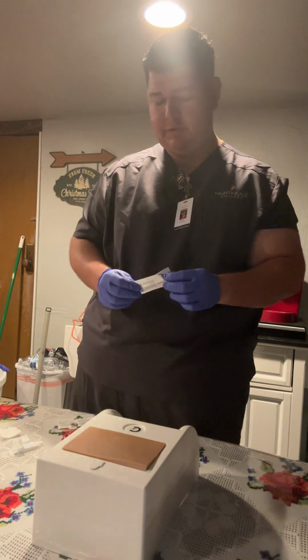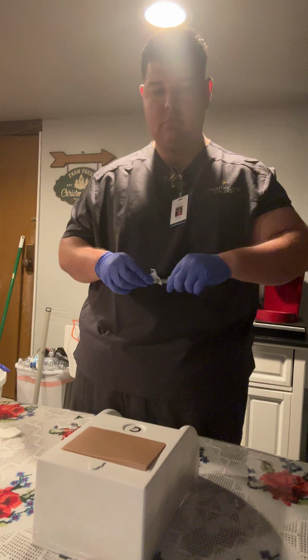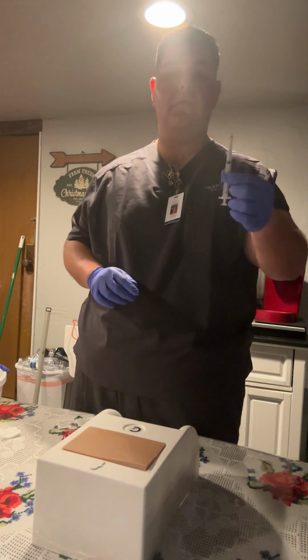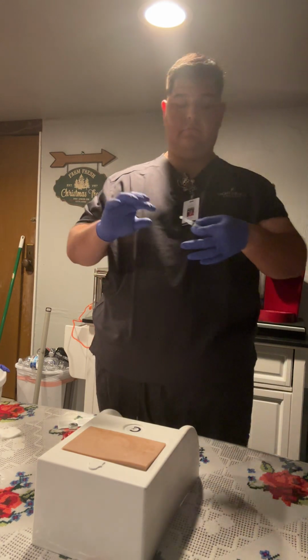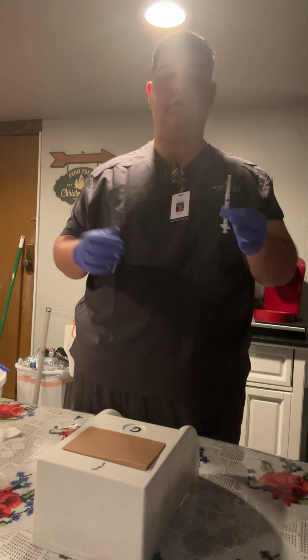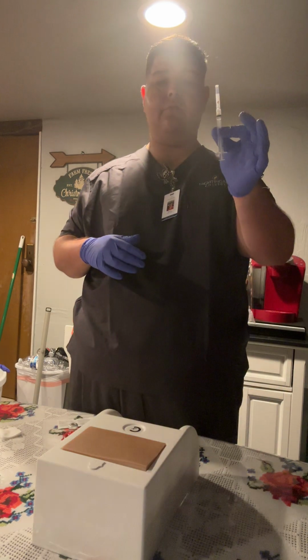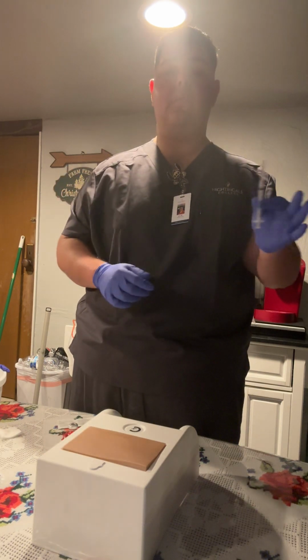I need to open my syringe and attach the needle. The needle's attached. And again, I'm using a 3 milliliter syringe and a 25 gauge 1-inch needle. I just placed it onto the end and twisted it on. So I want to add the desired amount of air into the syringe. I hold it up like a pencil with the needle up and the cap still on, and I'm going to draw 1.5 milliliters of air.